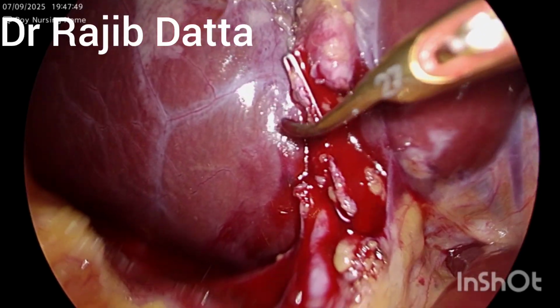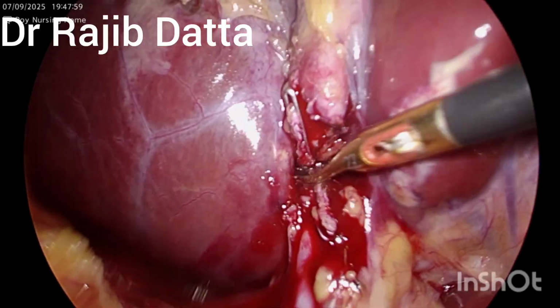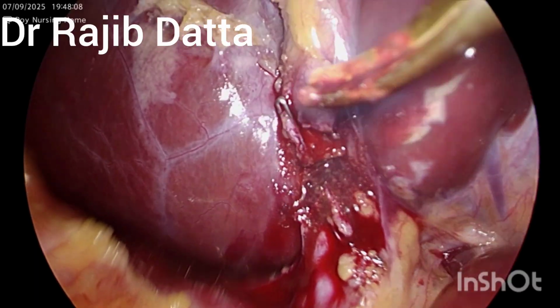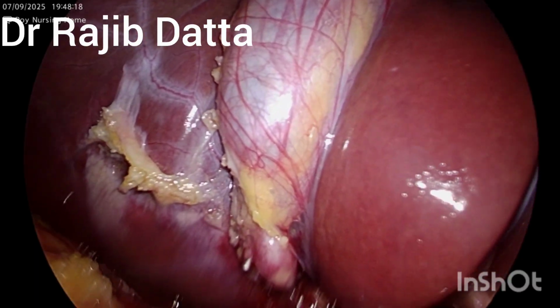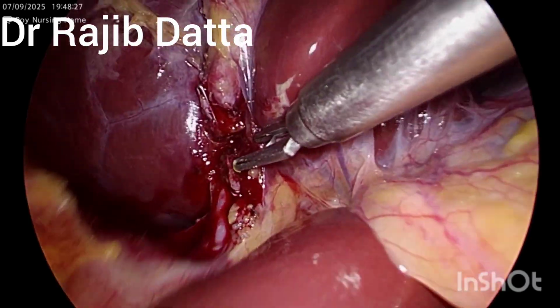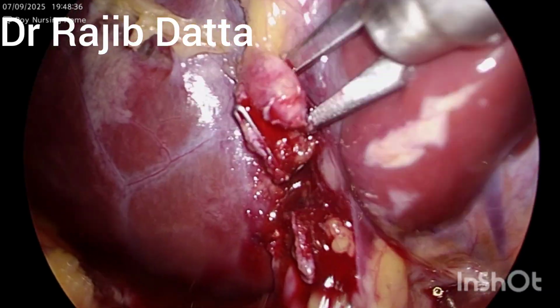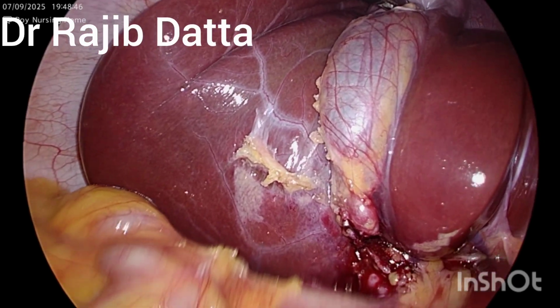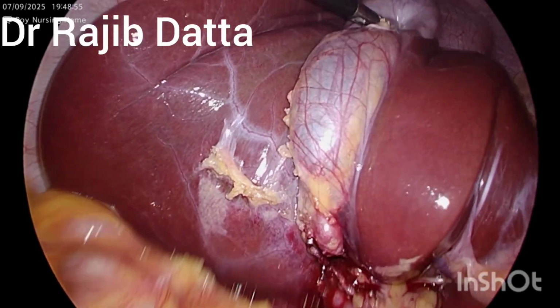And this bipolar shearer is an excellent one. It prevents the bleeding from the side, and you can apply the bipolar shearer just to block this bleeding. Sometimes you may not apply any clips, but here I am just going to apply a clip at the cystic artery for double prevention from bleeding post-operatively.